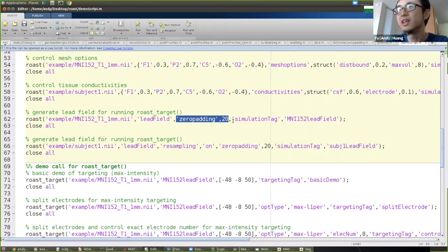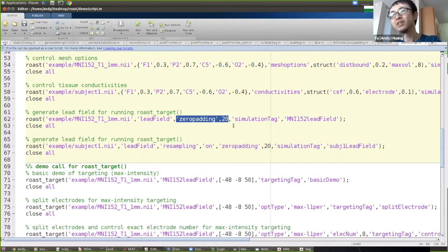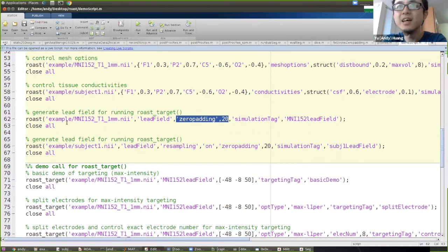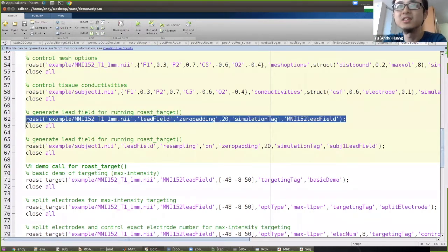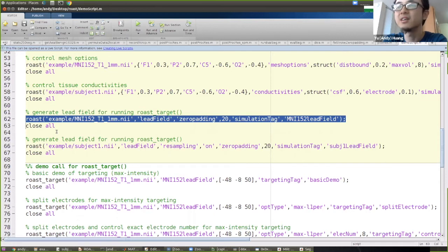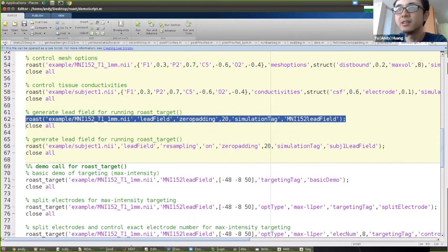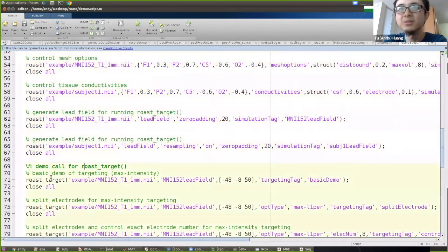The lead field generation process takes a long time — on a recent machine it takes about five to six hours. Once the lead field is generated, you can run ROAST target to do the actual targeting.